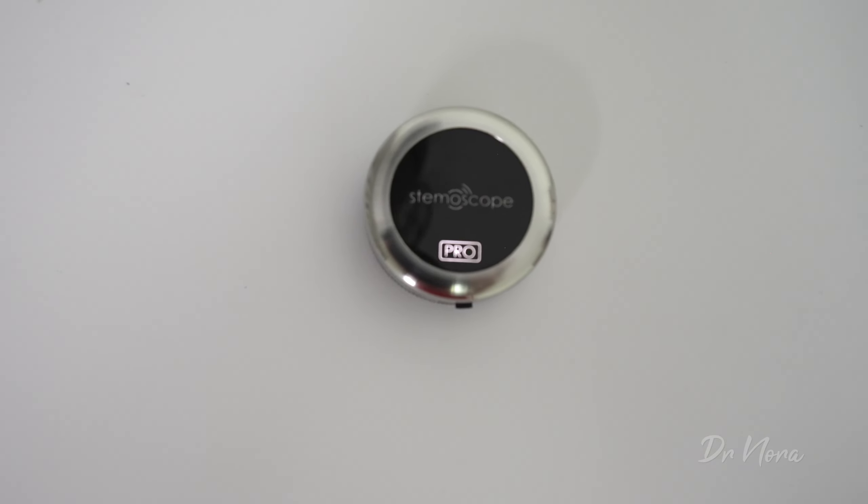For myself, this is actually a really big game changer because as you'll notice there are no tubes — it is not cumbersome like your original stethoscopes. It is literally just a small listening device with a diaphragm on the back so you can listen to your patient's heartbeats.